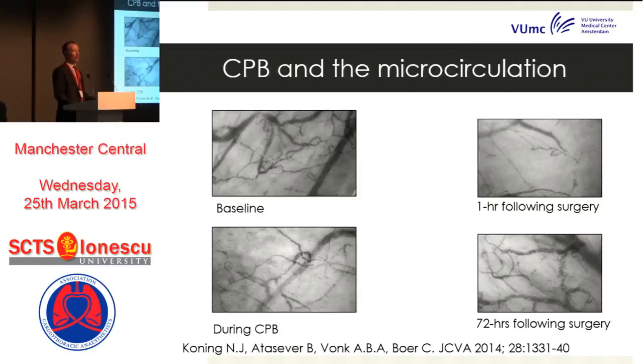Now, what side stream dark field imaging can't do is see if there are any GME or microbubbles passing through those capillaries exactly preceding the response that they've seen. I saw Chris de Boer present this last year, and so I communicated with them and said, do you think it is possible that this is due to GME in your human population? Because we know that whatever they do, they won't be able to eliminate GME.